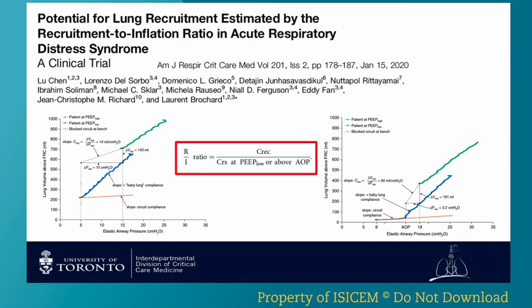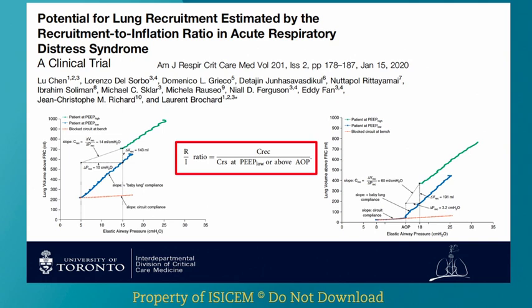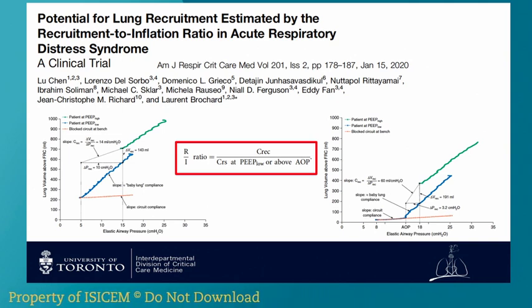And what this allows you to do is to say, is the high PEEP that I'm already using actually preventing de-recruitment? And in a single breath, when you drop PEEP from 15 to 5, for example, you watch and you see how much extra tidal volume is expelled in that single breath, and how much of that is related just to expected deflation.